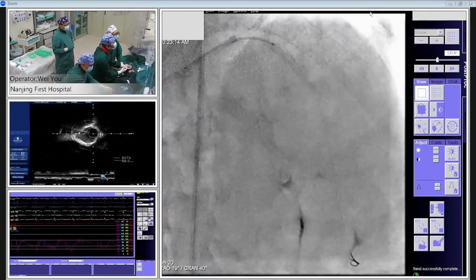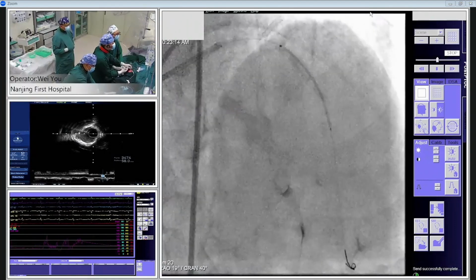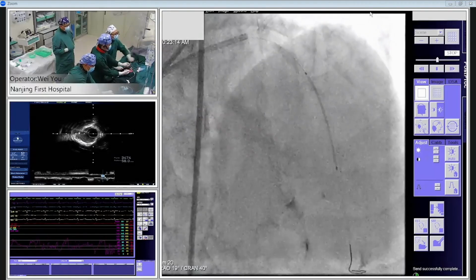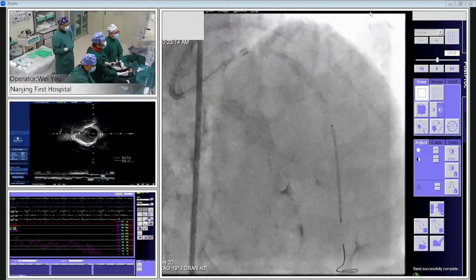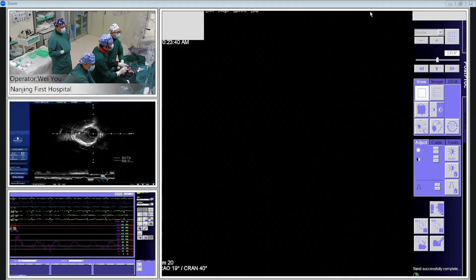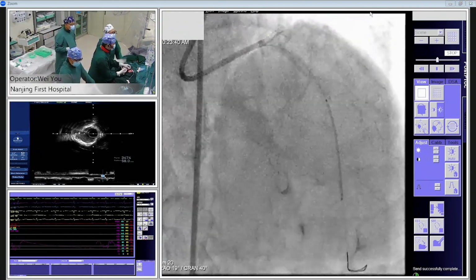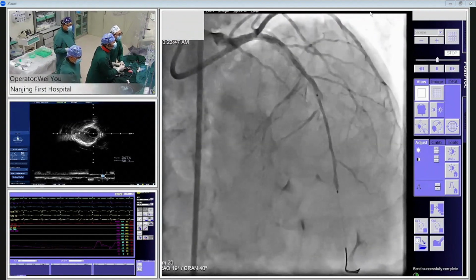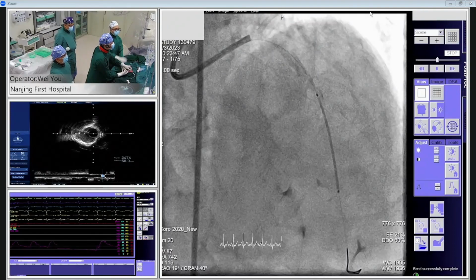Just test. It's the longest stent we have so far. A nice delivery. Very nice, because we use the extra support guide wire. Yeah, it's very important. Okay, test, please. Take a picture, please. So chief, I think here is okay. Just the last diagonal.